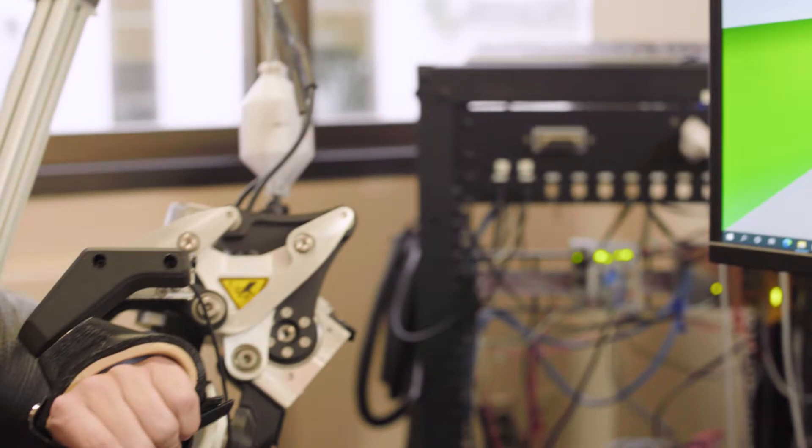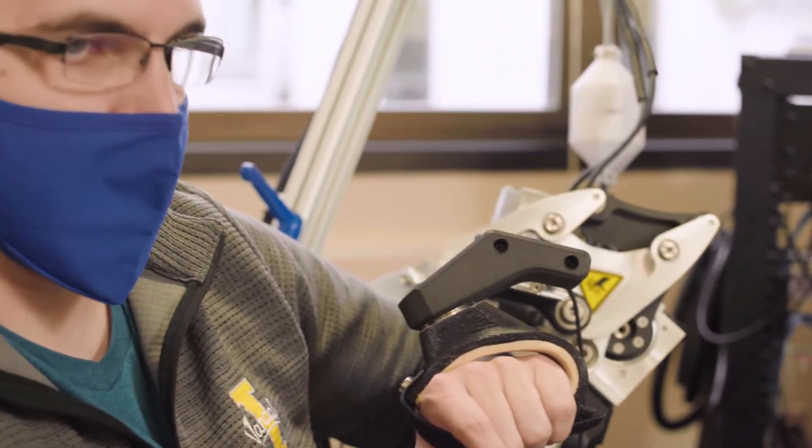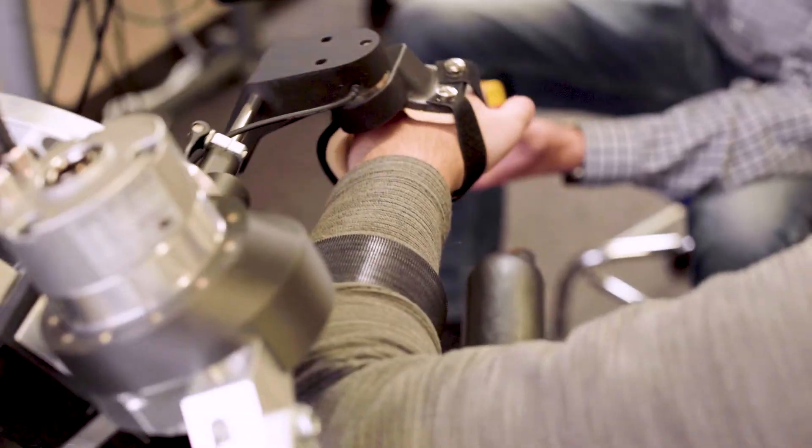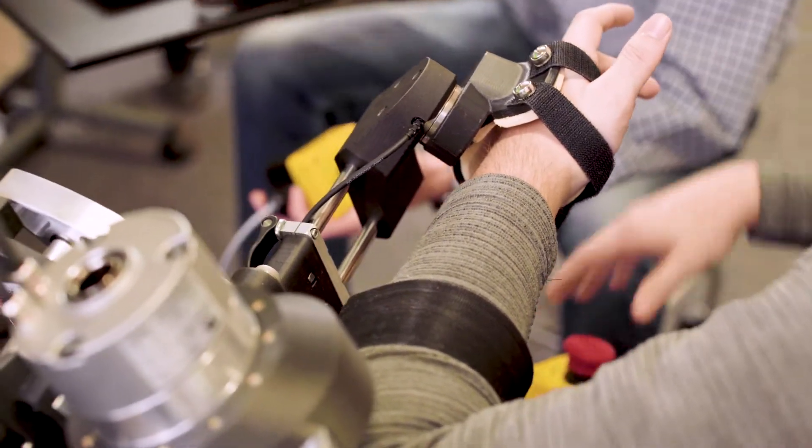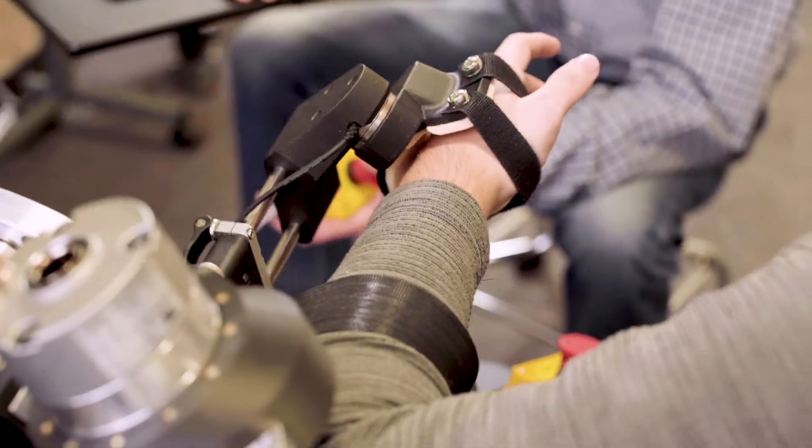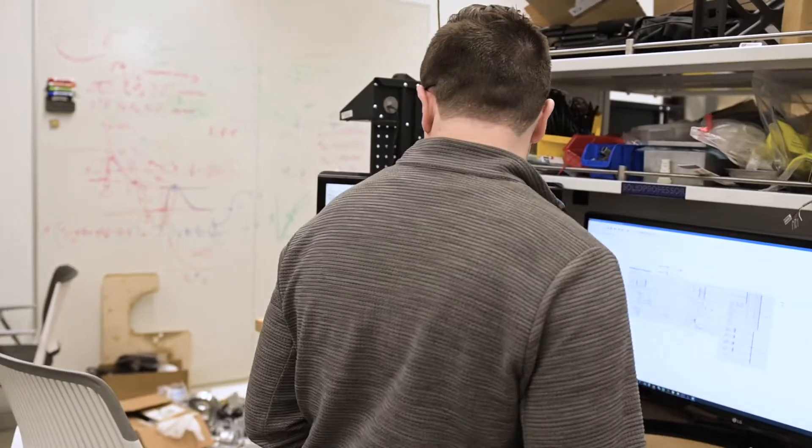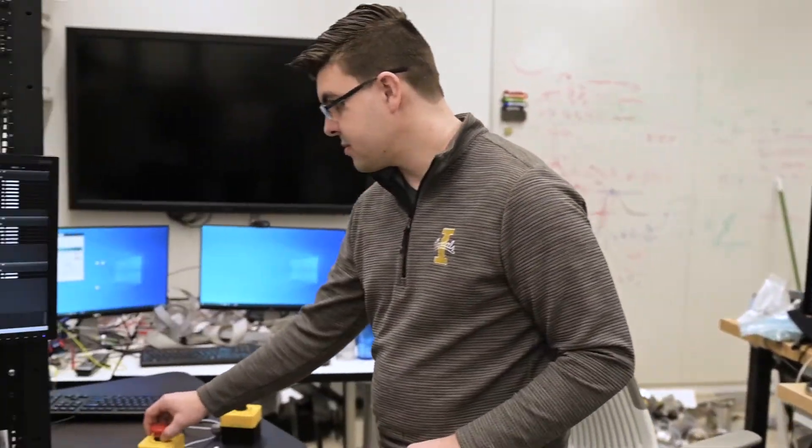We simultaneously record the signals in the brain to the arm so that you can try and take a fuller picture of how a healthy arm works but also how an impaired arm is working and how those connections are changing over time as somebody is going through therapy and recovering from stroke.